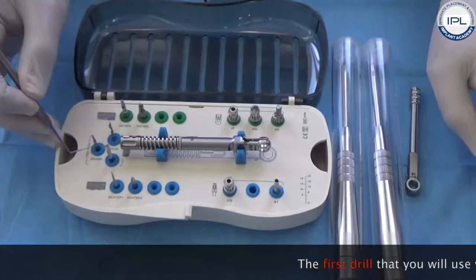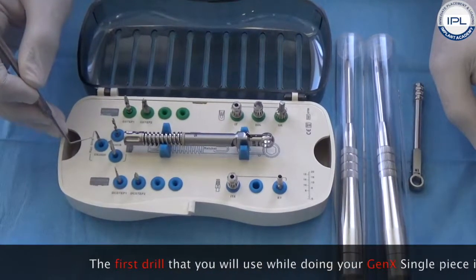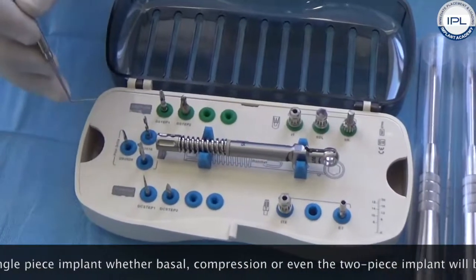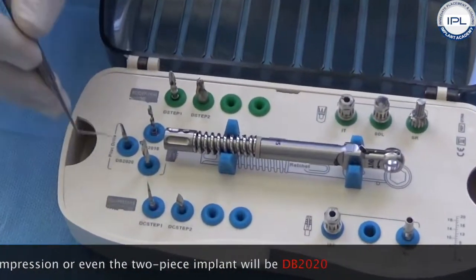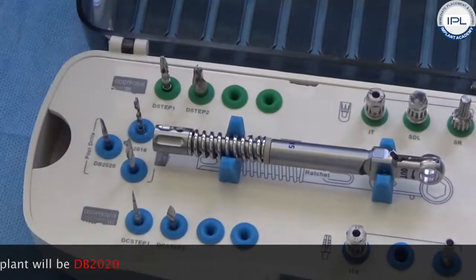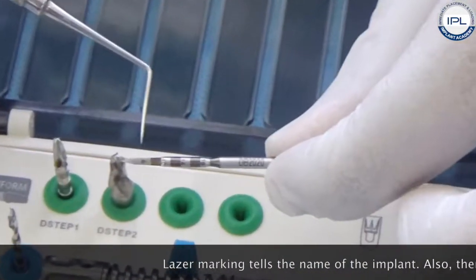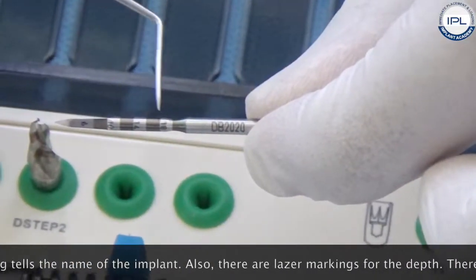The first drill you will use while doing your Gen X single-piece implants, whether basal or compressive, and even for the two-piece implant, is this drill DB2020. There is a laser marking here that tells you the name of the implant, and there are also different laser markings for the depth.